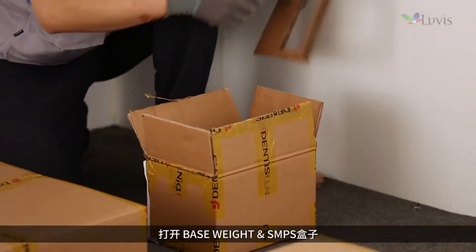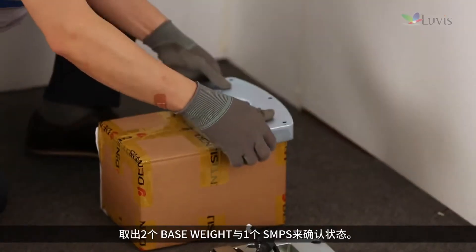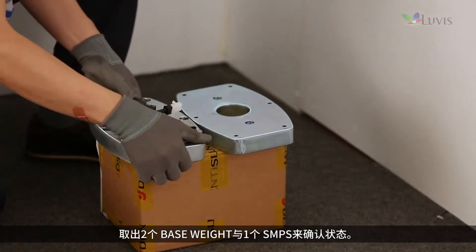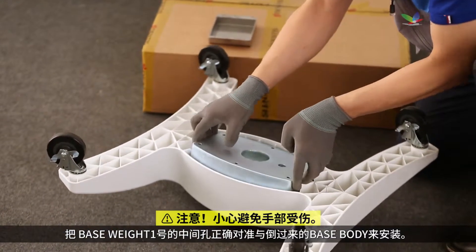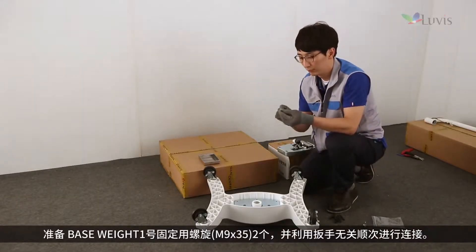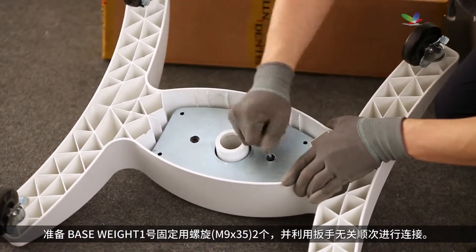Open the base weight and SMPS box. Take out two base weights and one SMPS to check their status. Align the middle groove of base weight number one to the turned-over base body to mount it. Prepare two screws to fix base weight number one and tighten them using a wrench, regardless of sequence.